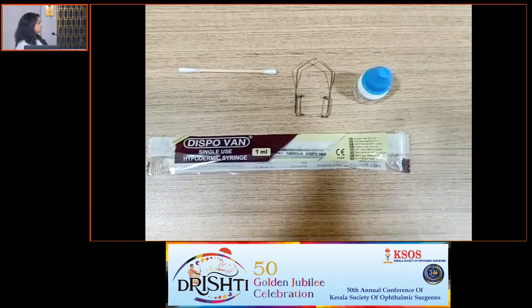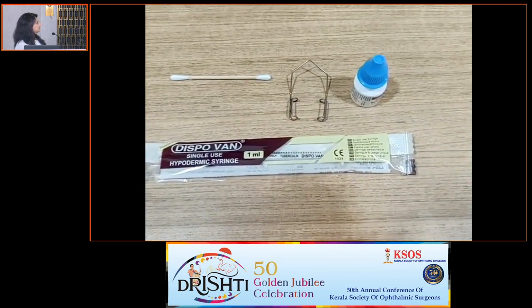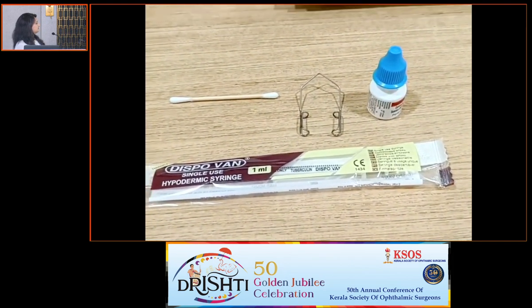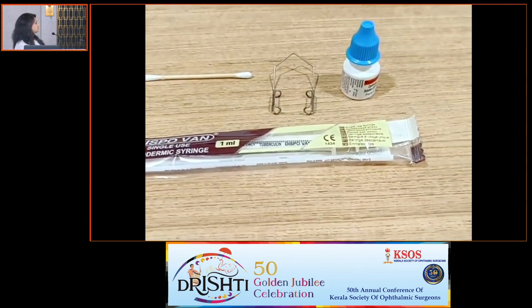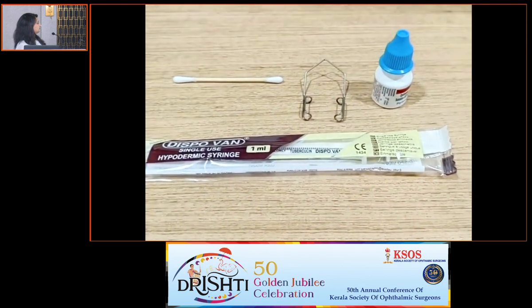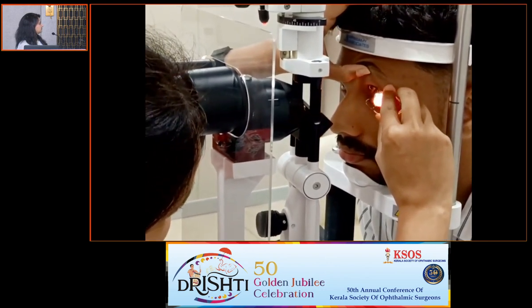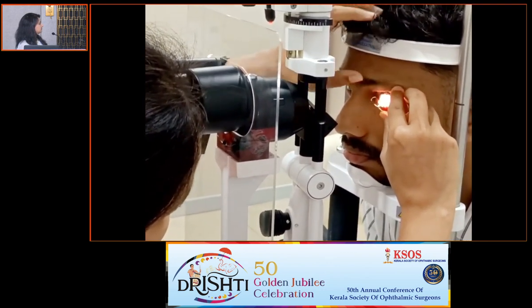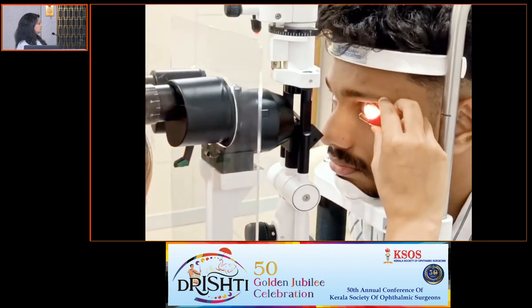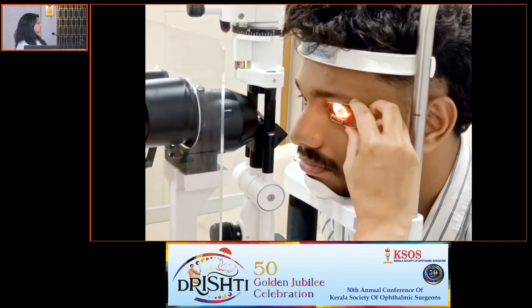For a corneal foreign body removal, you need a speculum, Paracaine, and either a burr or a 26 gauge needle. Normally it's difficult to hold the needle by itself, so it's always better to attach it to a syringe. Placement of the speculum is very important to prevent sudden closure of the eyelid or disturbance while removing the foreign body. Once the speculum is placed, the patient is asked to look straight at a point so that there is no movement of the eye.